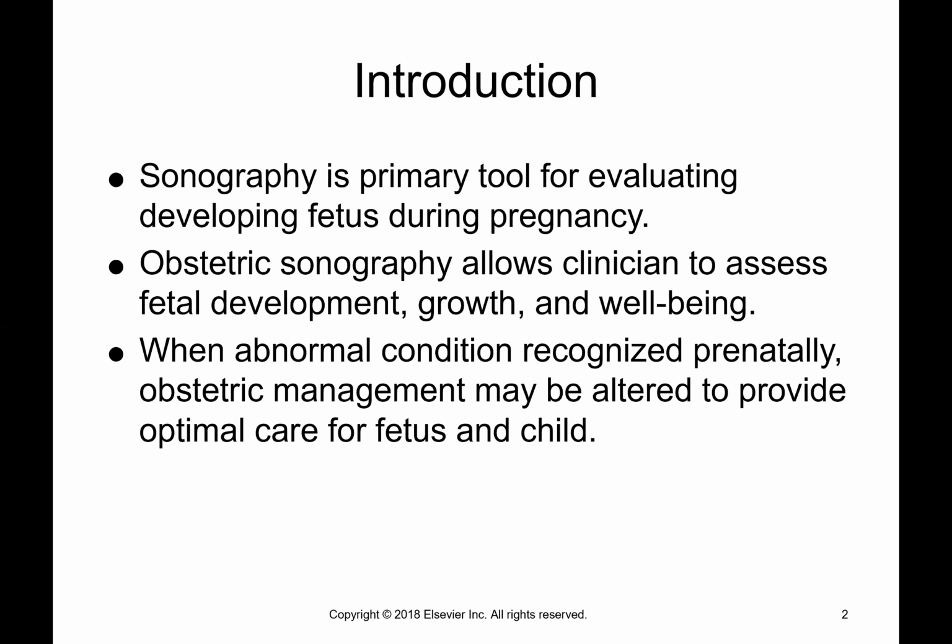If there is an abnormal condition with the fetus, a lot of the times they can manage it better if they know exactly what's going on. If a baby needs heart surgery right out after delivery, they can be in a certain center that does that. Or if a baby has some other kind of abnormal growth pattern, we can keep watching it to make sure that they're still doing well in the womb. So sonography is definitely a very good tool to use when we're monitoring pregnancies.